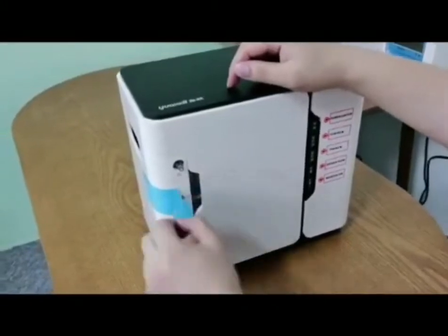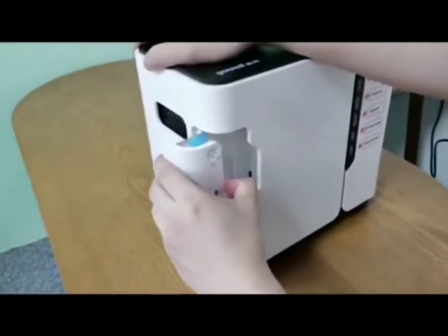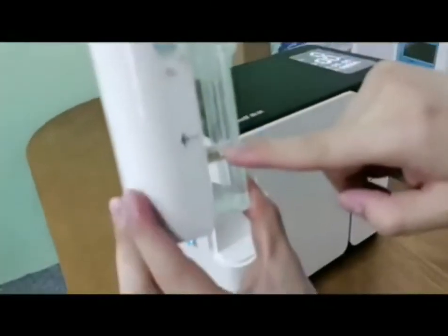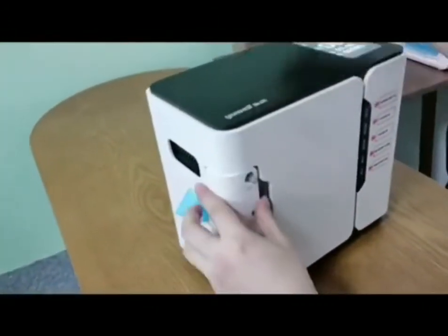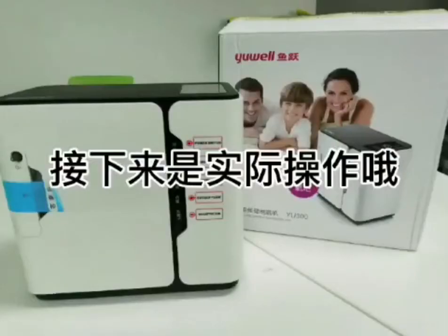We peel off the sticker, open up the water container, and make sure the water is filled up to no more than the maximum level shown here. The cap must be closed nicely, then we put it back.